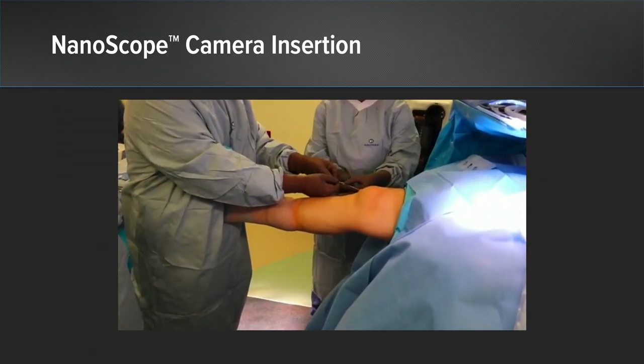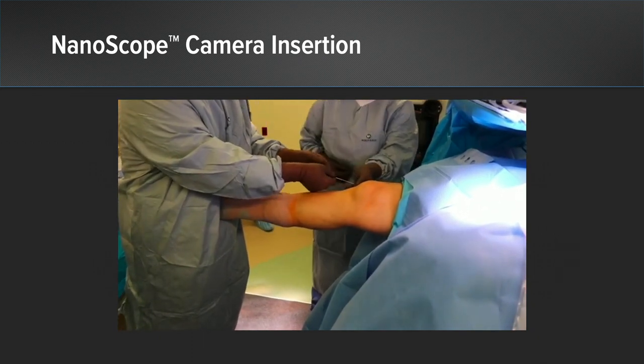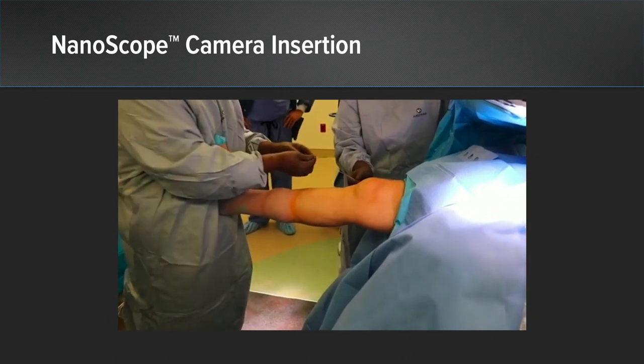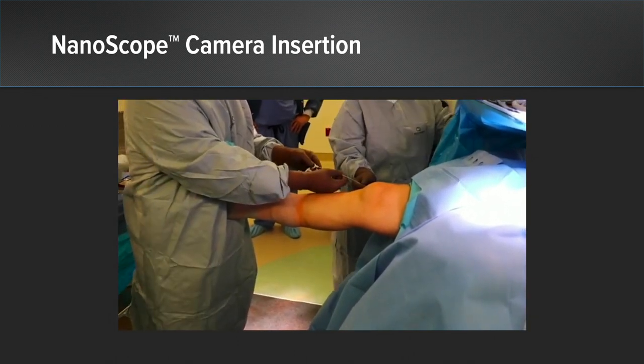We began by placing a spinal needle into the knee joint through which a guidewire is passed. The spinal needle then gets removed and replaced with a 2.2 millimeter nanosheath. The nanoscope gets inserted into that sheath and inflow gets started into that nanosheath.